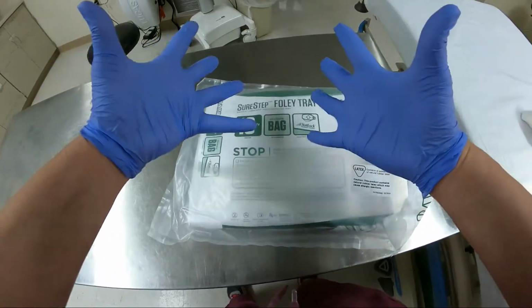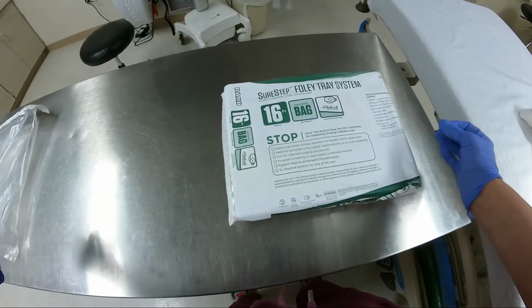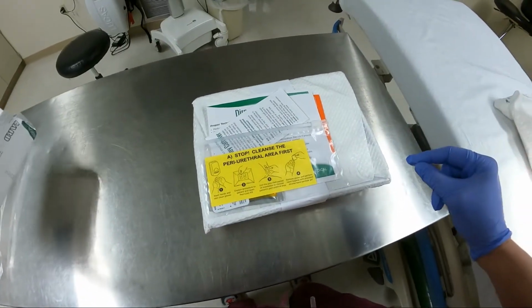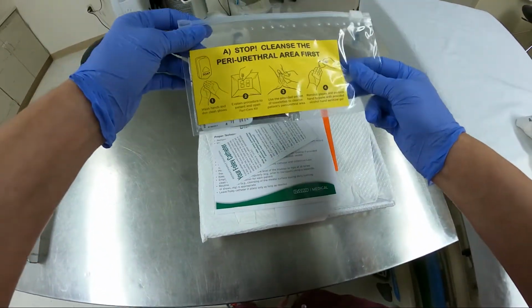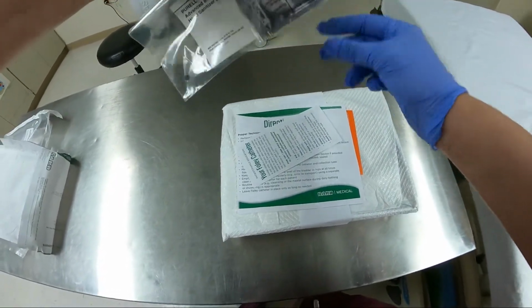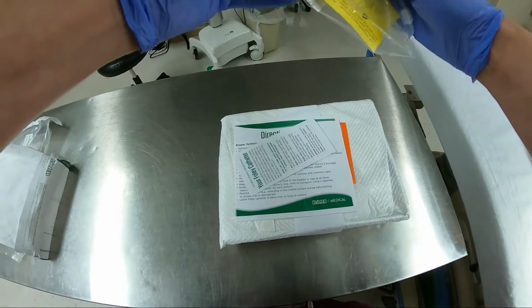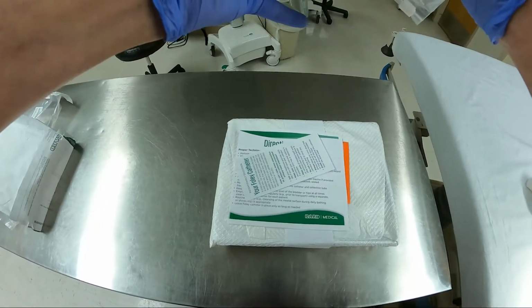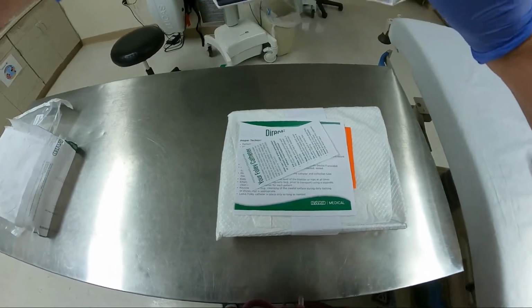So we've also, by the way, changed our gloves again, because once you clean up such areas, you need to take off the gloves, clean your hands, put new gloves on. Now, the kit is set up in a certain way. Take off the overwrap. Now we have this. So you've got this little kit first, and it's got some hand sanitizer gel in there, and you can wash your hands with that, and it's also got Castile soap in there. I believe that's what that is.